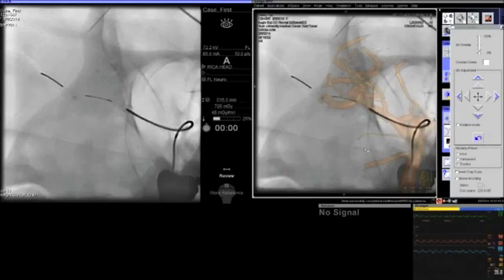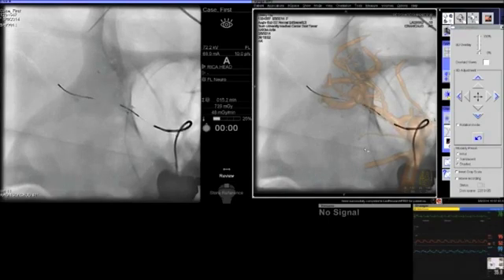And once you have this stent deployed, sometimes the wire can get caught. You can see right there that you can have a little bit of resistance to pull the wire back out of the delivery system of the stent. This has to be done very carefully, so you may have to push forward and then back so that you're able to release the wire from the two stents.